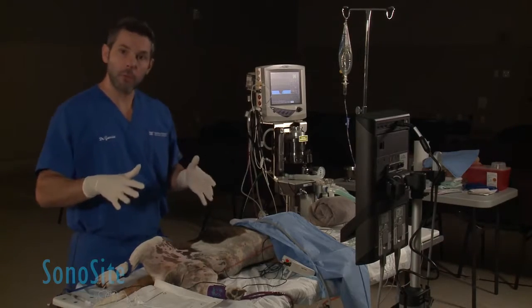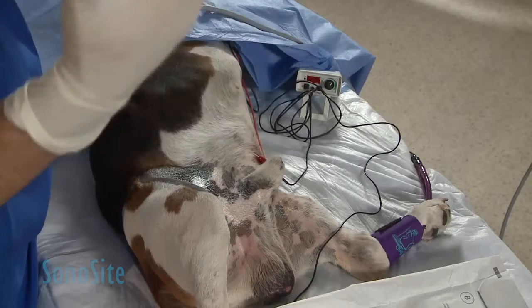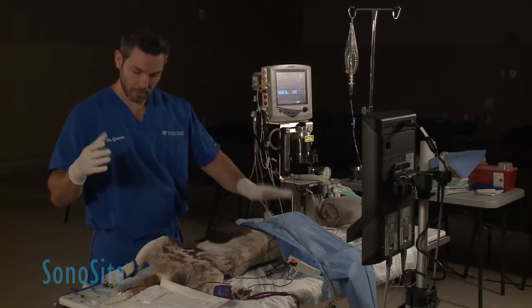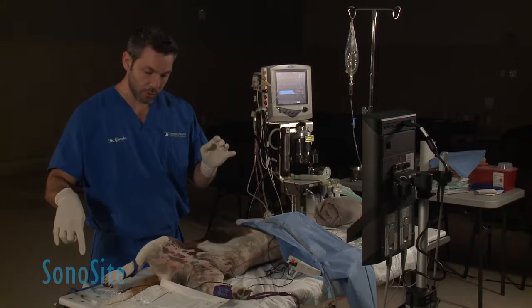Now that we have already prepped the dog — we've scrubbed, everything is prepped, put sterile gloves on — I have everything set up, my nerve stimulator is already on, and I have the needle flush here. Obviously someone's going to need to come and help me to inject this.